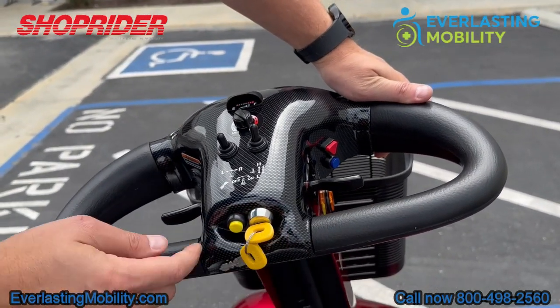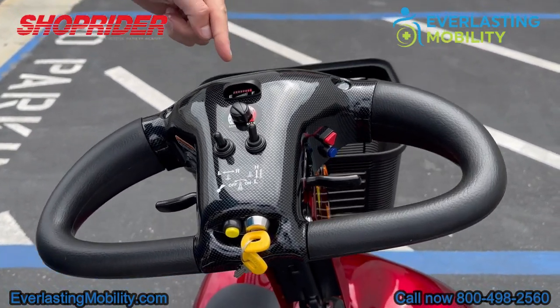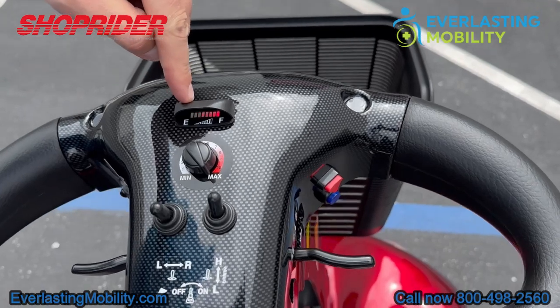The scooter comes with two keys. This button is your horn button. Up top here is your battery gauge, so you can see when it's time to recharge the batteries.